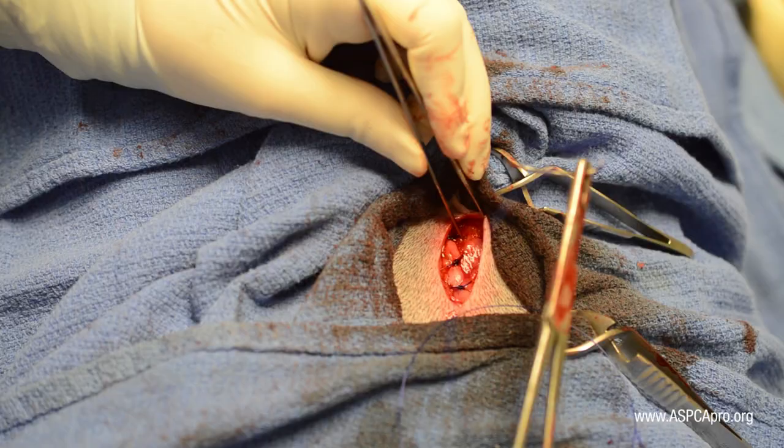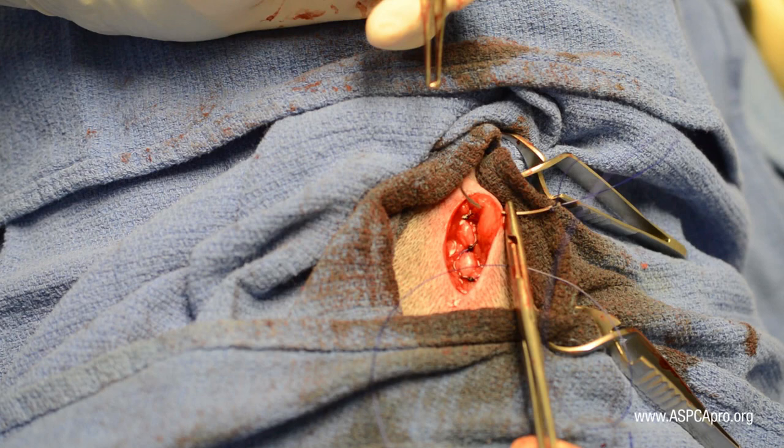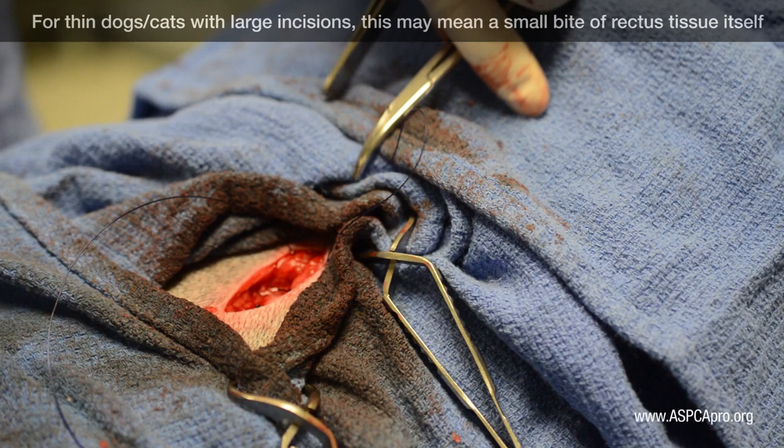The subcutaneous tissue and skin are closed using one continuous piece of suture material. Begin by taking a bite of deep subcutaneous tissue at the cranial end of the incision. Once this bite is taken, grasp the free end of suture with a pair of hemostats and place them on the sterile field.